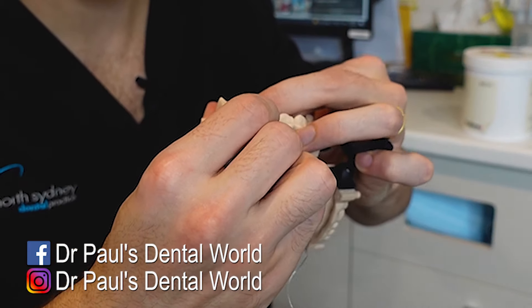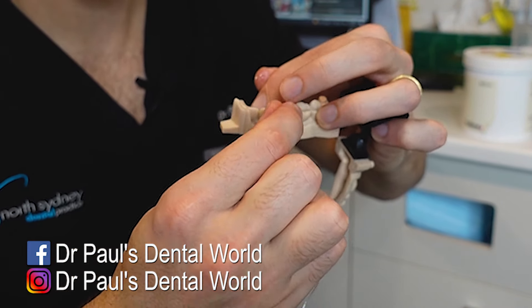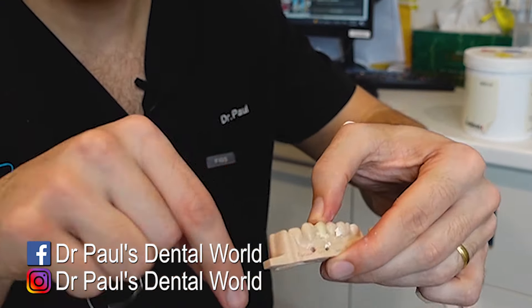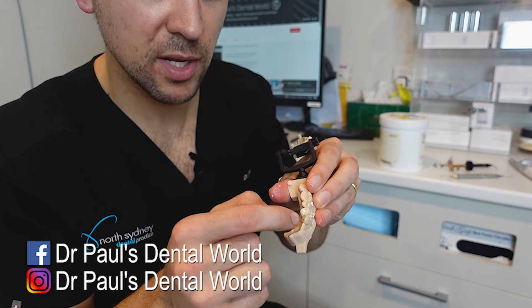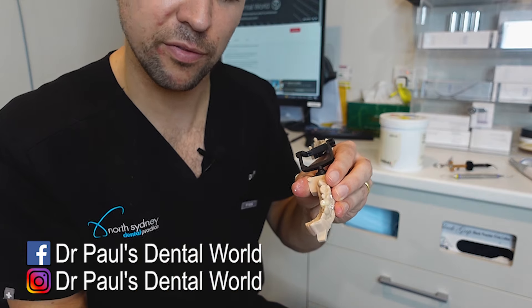Floss in between, up and down, and then slide out. And then I'll go around with my ultrasonic. With that top bit, you can leave it like that if you want to — often the temporary cement will stay there. Or you can use your ultrasonic to remove it and then fill it with flow.